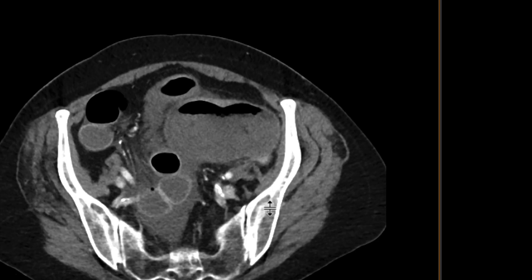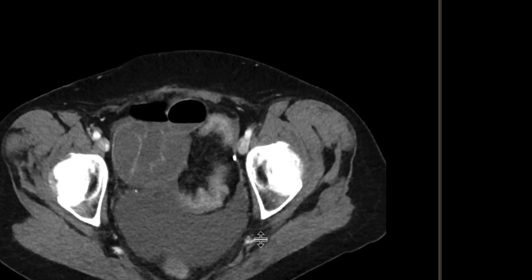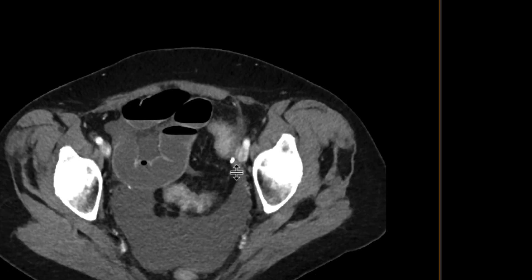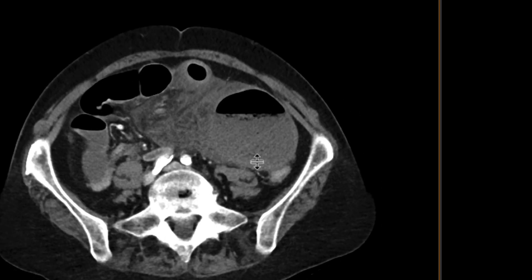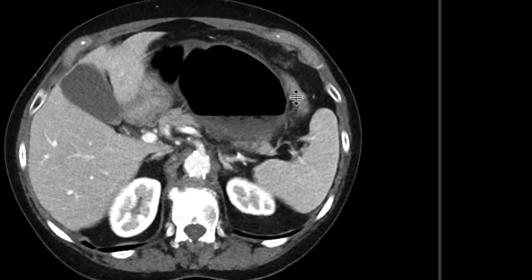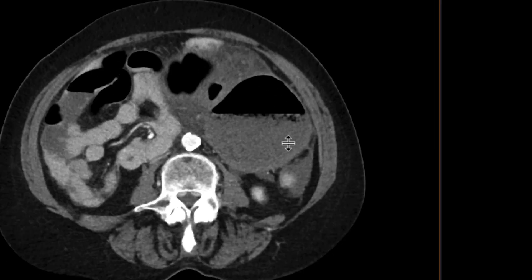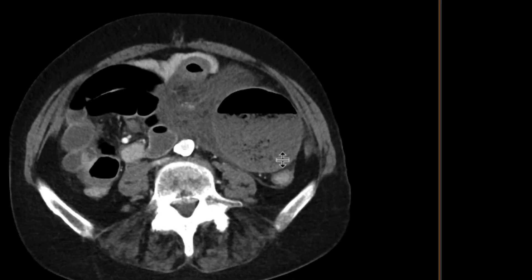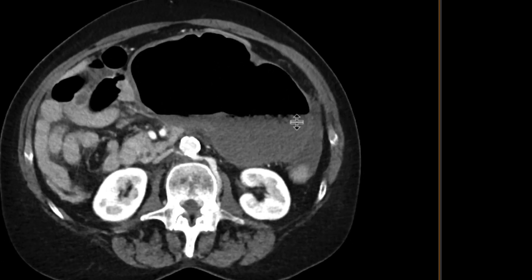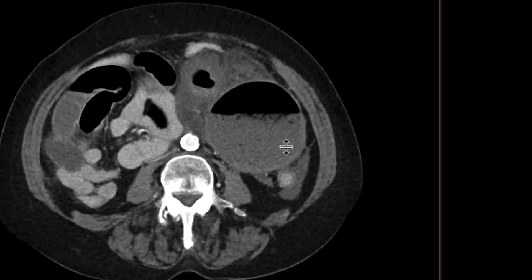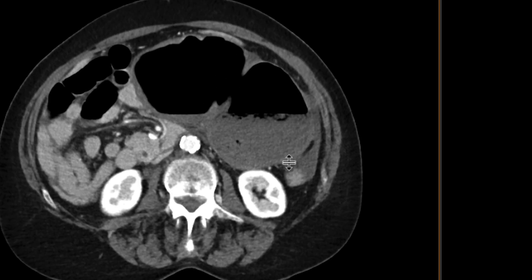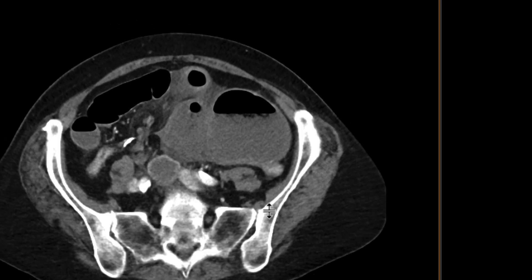So what loop does this represent? Going downwards, we can see that it's not the sigmoid colon — the sigmoid colon looks collapsed and separate from this. It's not the descending colon, and it's not the transverse colon, which is sort of anterior to this loop. As we go downwards, we can start to appreciate that this probably represents the ascending colon and the cecum. We can then appreciate this loop of bowel going into it — it's probably going to be the terminal ileum.